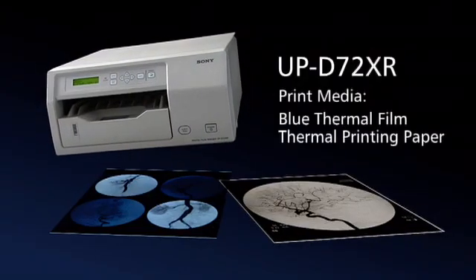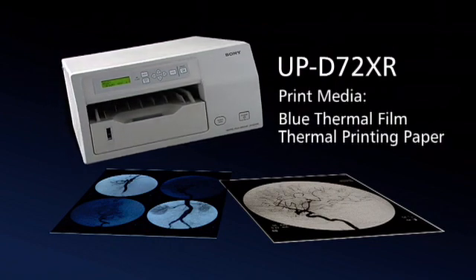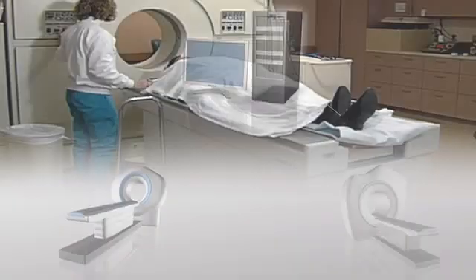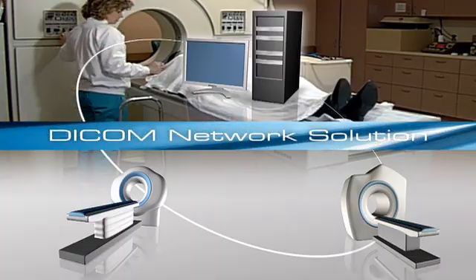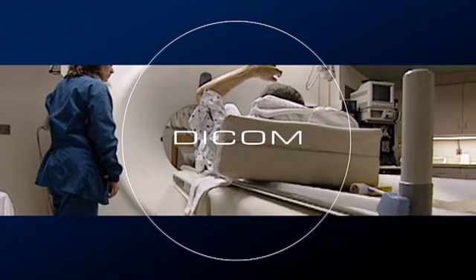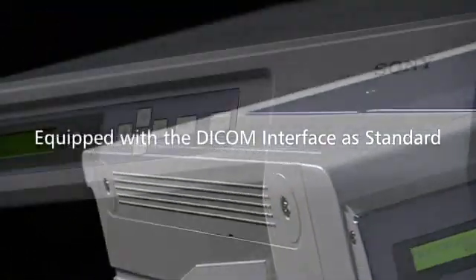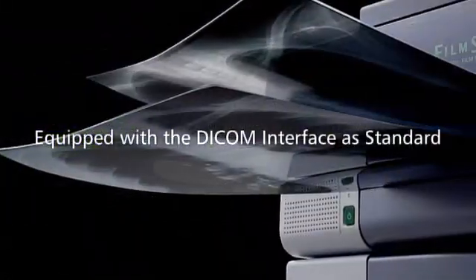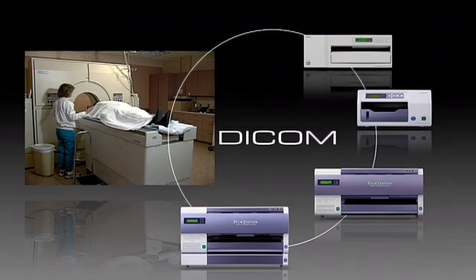The UP970AD can print 8 by 10 inch size prints in black and white on both sheet type paper and film. Recently, the DICOM network has become increasingly important for radiology modalities within the hospital infrastructure. Sony's printers for radiology modalities are equipped with the DICOM interface as standard, making it easy to connect printers to the DICOM network, which helps increase operational efficiency and compatibility.